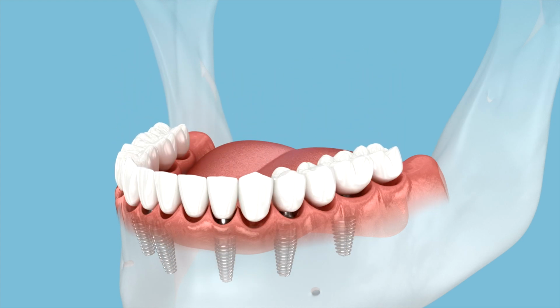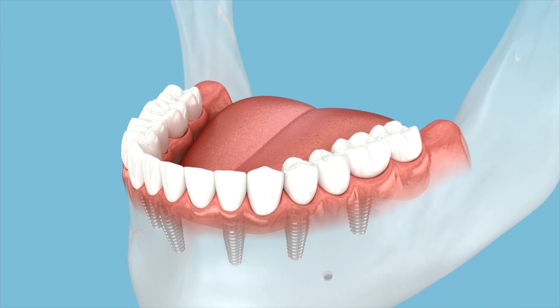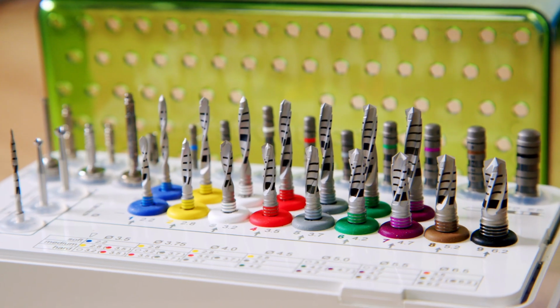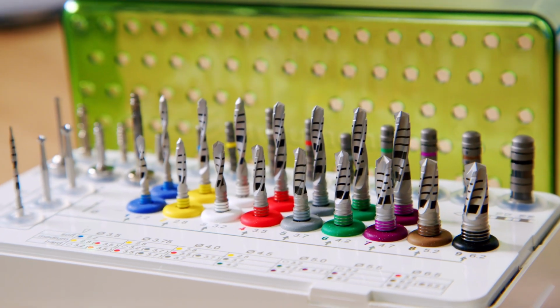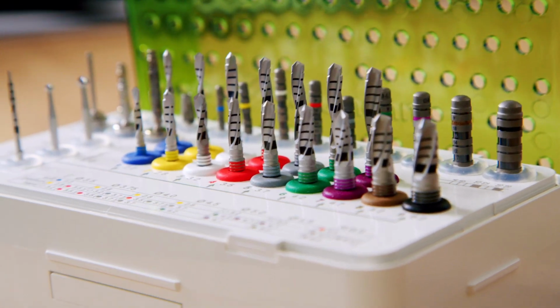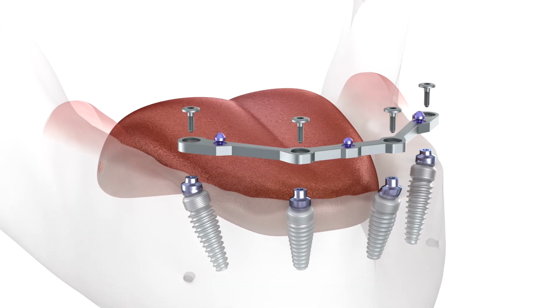Surgeons must always measure the distance from the alveolar crest to the nerve canal with extreme precision. A minimum safety margin of 2 millimeters is the standard. In some cases, bone grafting or shorter implants may be needed to maintain this safety zone.